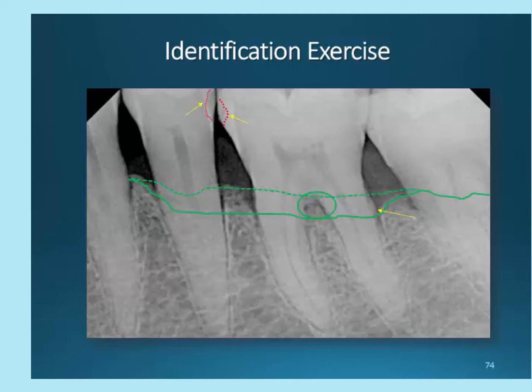What about the periodontal classification? If you guessed stage 3, you are correct. I see a furcation that is beginning, so that tells me it is not stage 2. I see crestal bone changes that have actually eroded away the entire alveolar crest between 20 and 19 and between 19 and 18. That's right, you have gotten to learn your teeth numbers here.